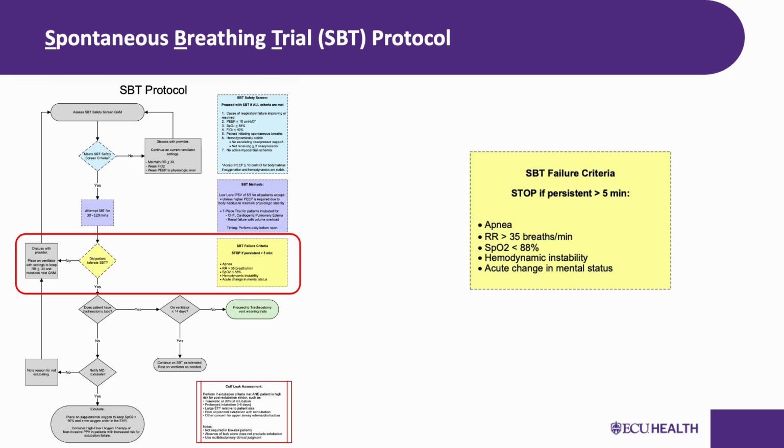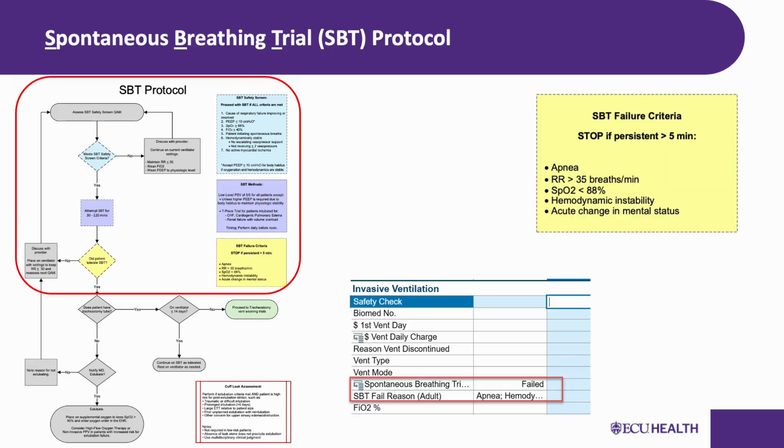When you identify failure, return the patient to previous comfortable ventilator settings, not just back to the pre-trial settings, but to settings when the patient can actually rest comfortably. Document the failure, which we'll cover on the next slide, and communicate with the care team on the outcome.